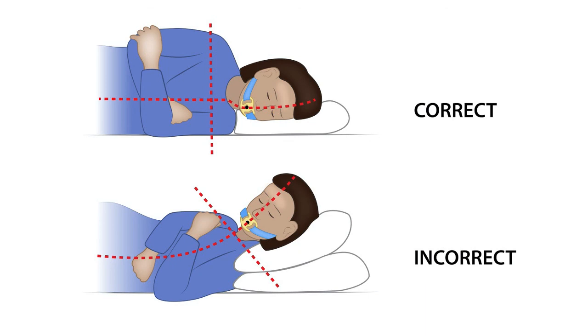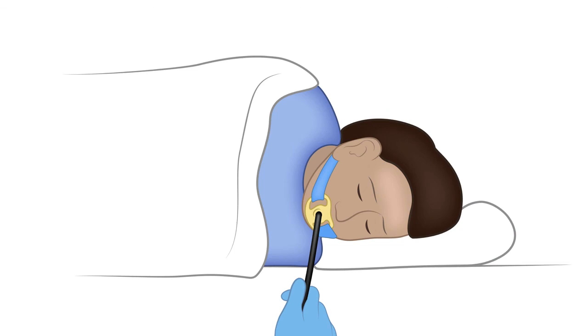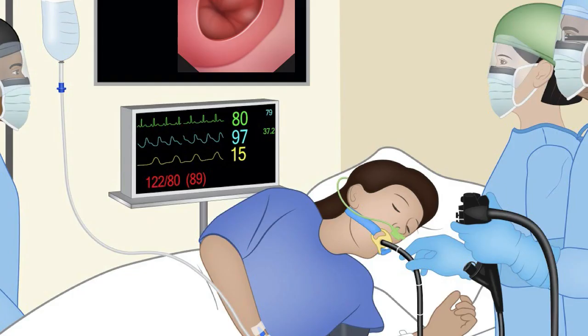And once the patient is on the left side, square, neck and head and spine in line, the endoscopist can easily do the procedure because the insertion is relatively straight into the esophagus. And as the procedure goes on, you pay close attention to what the endoscopist is doing. And as you get experienced, you can anticipate what needs to be done and be ahead of the game.